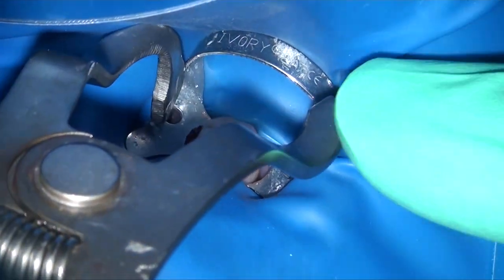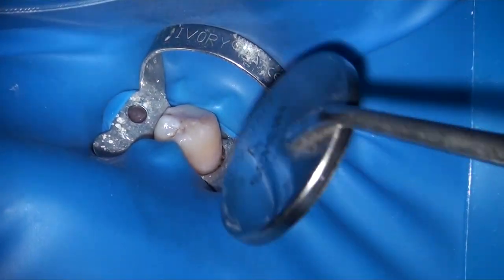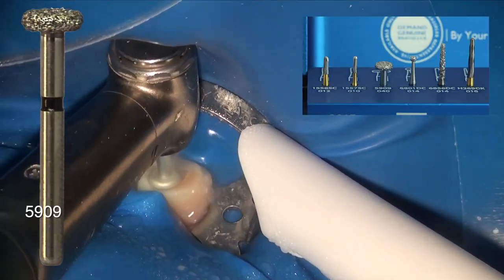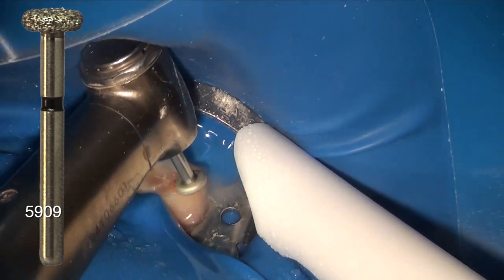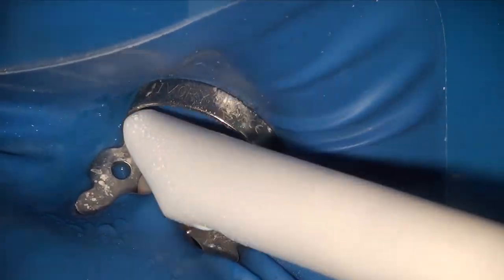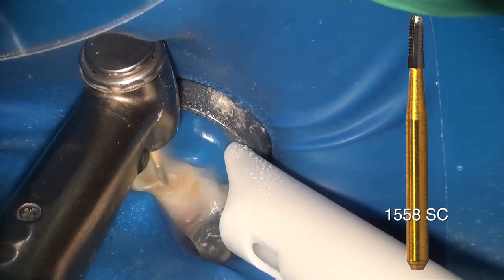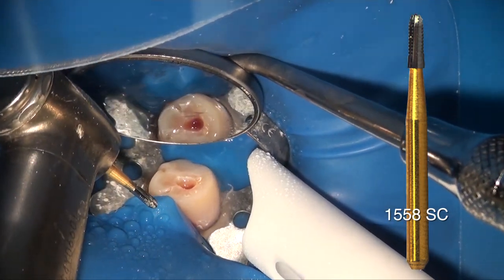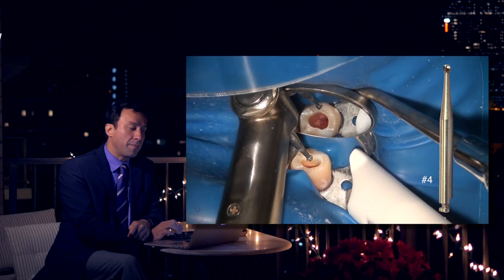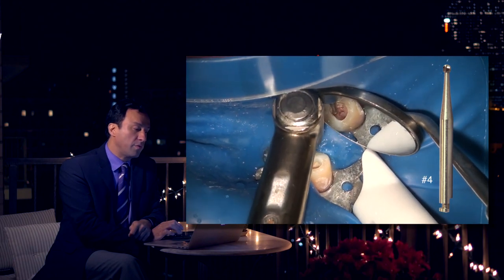We isolate it using a 2-AT clamp, and then using the Real World Endo access preparation kit, I'm using a flat diamond to flatten out the cusps because this tooth will require a crown. Flattening the cusps allows more stable reference points as well as taking the tooth out of bite. Using the saber cut bur, I've made my outline form, and now I'm using a number 4 round bur at slow speed to remove the decay.